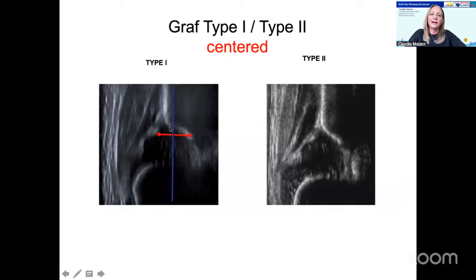The difference now between a centered type 1 hip and a centered type 2 hip is essentially not a percentage, but the amount of coverage, provided by the bone right up to the turning point, and from the turning point, the hip is covered by the cartilage. This relation between how much of the femoral head is covered by bone versus cartilage can give you an idea whether a hip has a good bony roof or if the bony roof is adequate.